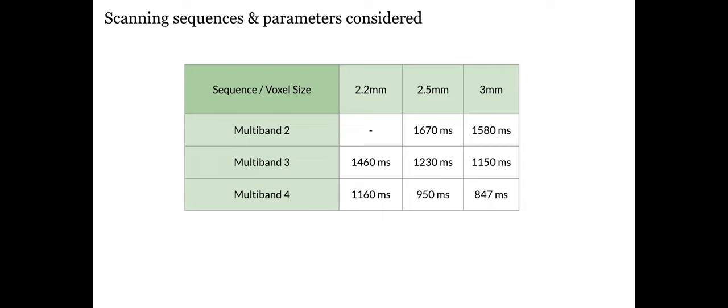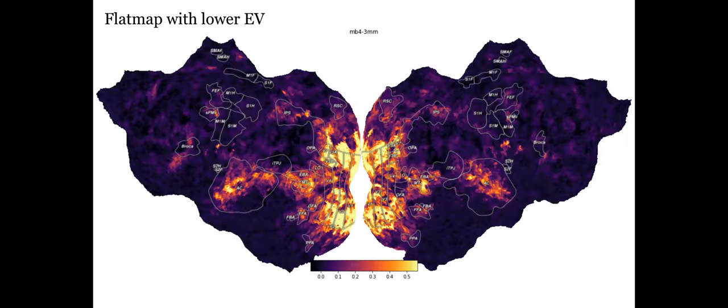So I guess in the last part, when you were showing the images and looking at where there was higher SNR relative to different regions of the brain, did you consider calculating those metrics separately for different regions and then trying to compare with that, instead of just calculating it for all of the voxels across the brain?